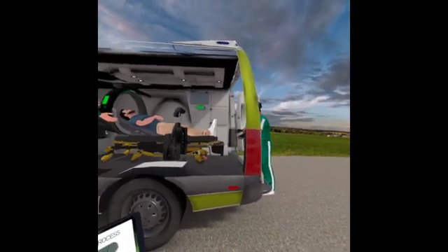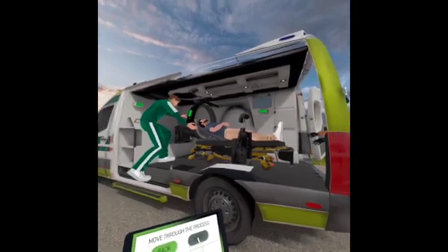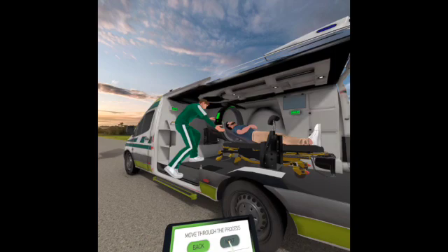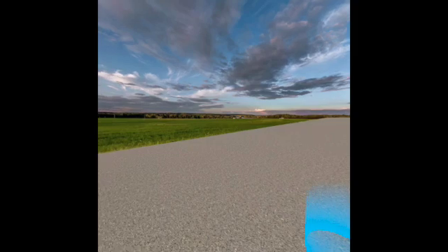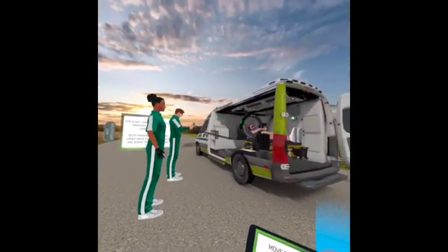Once the imager setup is completed, the patient is brought into the ambulance while the stroke paramedic ensures that the positioning aid device does not interfere with the detector. The stroke paramedic grabs the tablet and activation switch from the seat compartment, then both paramedics exit the ambulance and confirm that they're ready to begin.